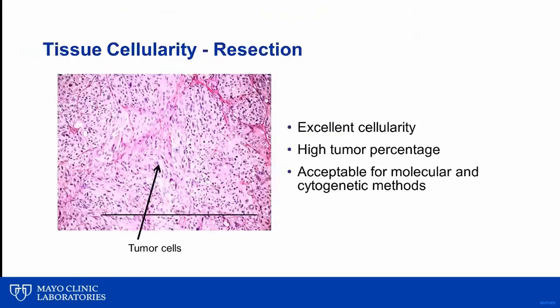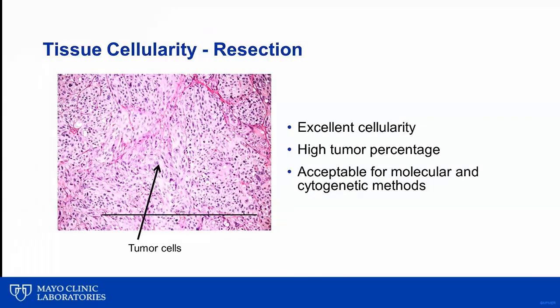This resection tissue has fantastic cellularity and a high tumor percent, so this is likely a specimen that would yield enough nucleic acid and would be acceptable for molecular and cytogenetic methods. When looking at small biopsies, it is not just the size of the tissue but the cellularity and tumor percent that matter. The biopsy on the left has high cellularity and high percent tumor nuclei and is likely acceptable for most molecular and cytogenetic methods, despite the tissue being only a couple of millimeters. The biopsy on the right, however, while similar in size, does not have many nuclei present and even fewer tumor nuclei, so it would be inadequate for most cytogenetic and molecular methods.